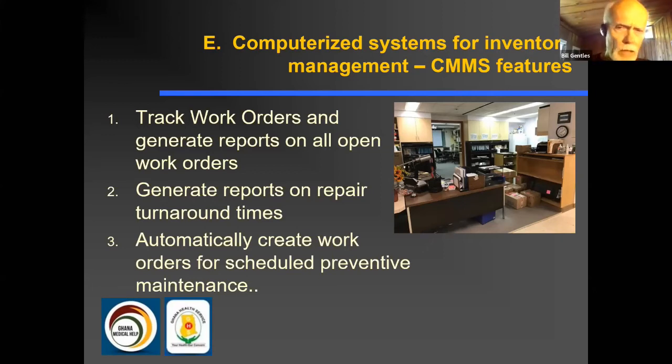So you've got two different brands of oxygen concentrator. With one, the spare parts you can get in a week, and the other one, it takes 6 months. Once you've got this kind of database, that you can quickly collect that kind of information across the whole country and make some procurement decisions based on things like availability of spare parts and how quickly you can get them.